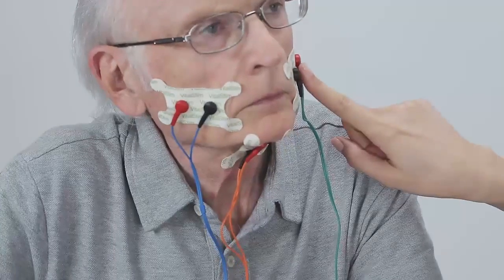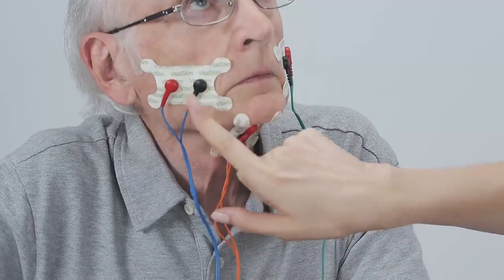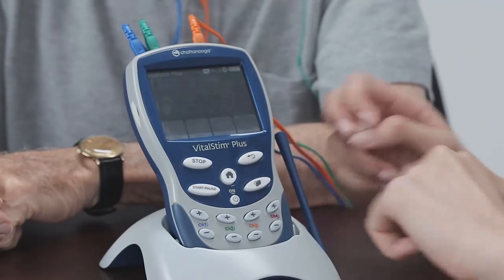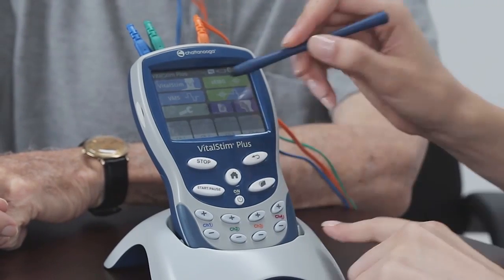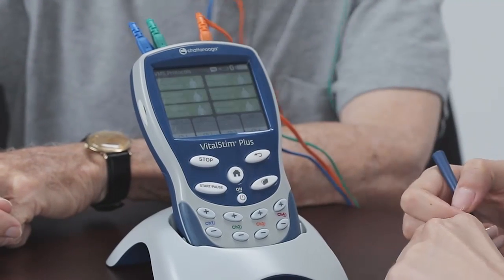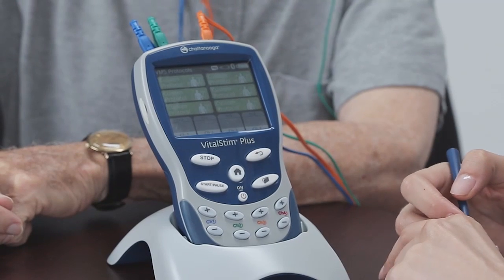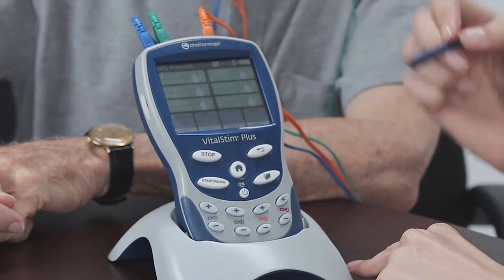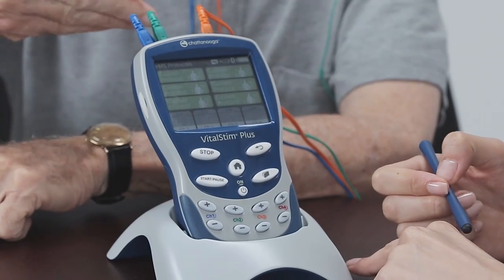2 of them are stimulating the oropharyngeal sling to facilitate muscle function during the oral phase of the swallow, and 1 of them is over the geniohyoid at the bottom to facilitate hyoid protraction. Let's first turn on the unit and then select VMS. The green buttons on the screen allow one to access custom protocols that have previously been saved. We will pick any one of these right now and then edit the settings inside there.